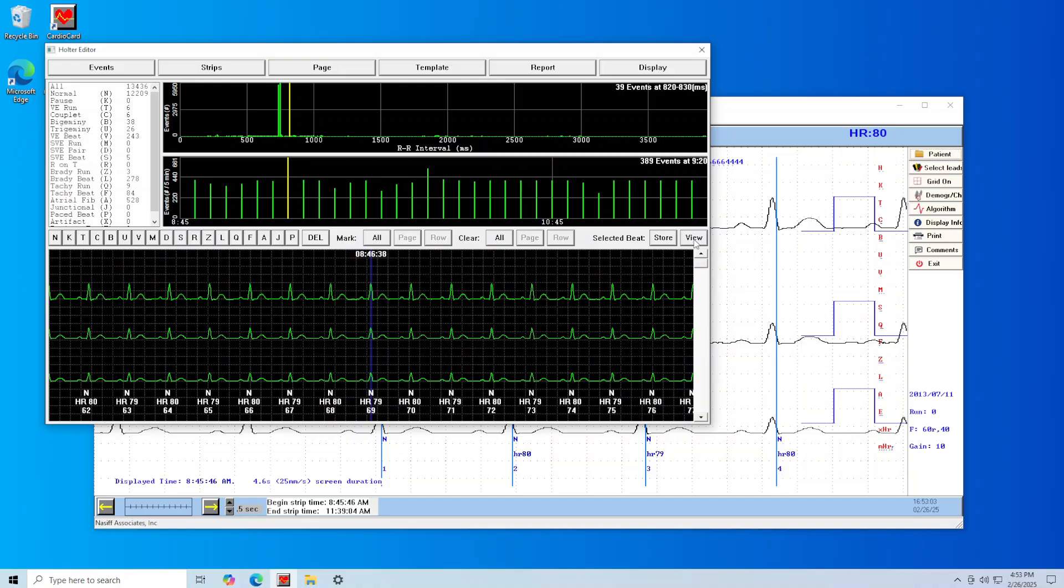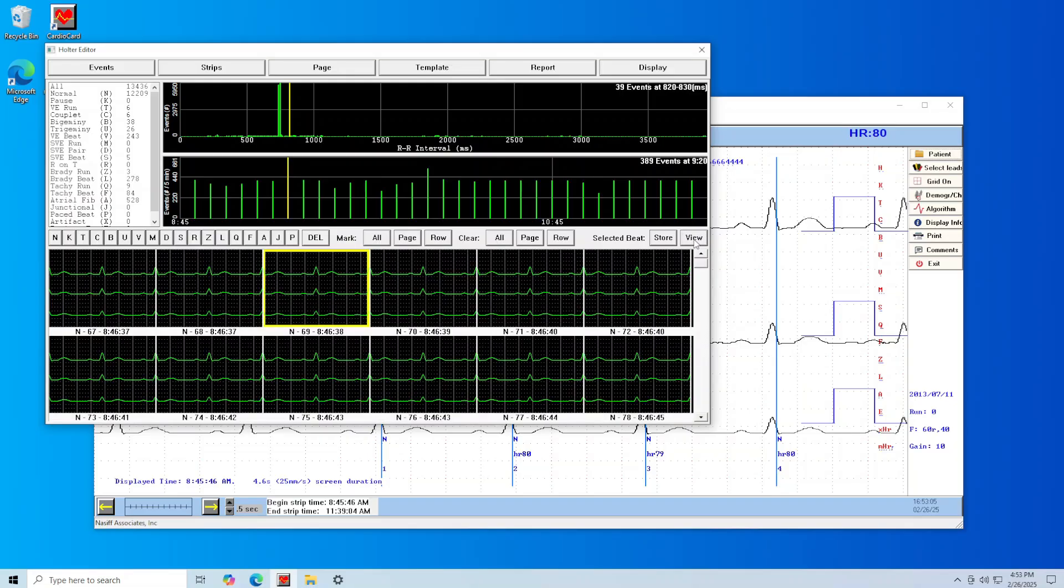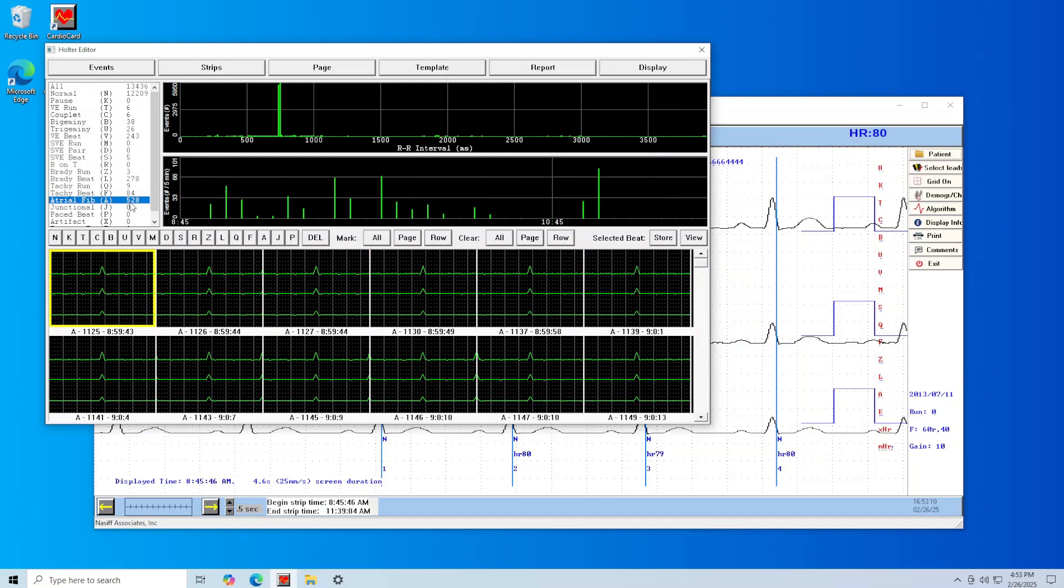To view different event types, simply click on the event type at the top left and inspect the beat selections in view. To edit beats, double click on the beat section in the condensed editor.